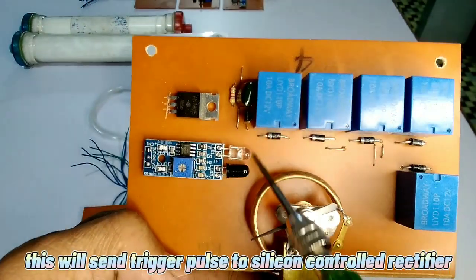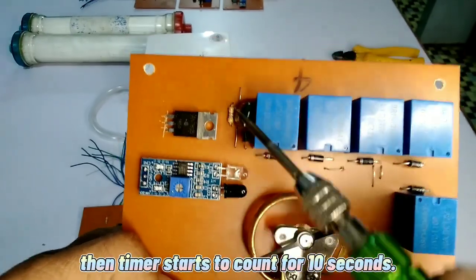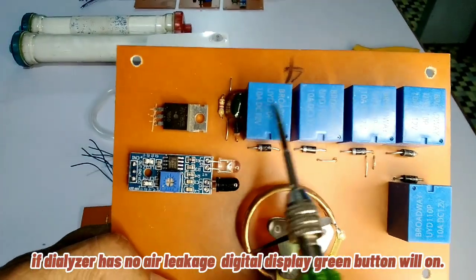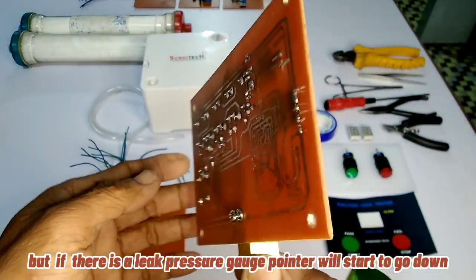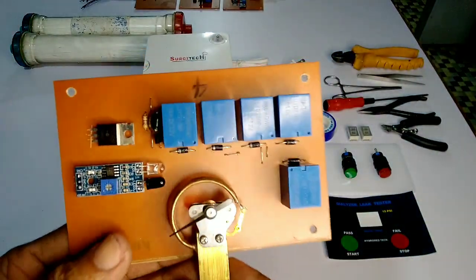This will send a trigger pulse to the silicon-controlled rectifier, then the timer starts to count for 10 seconds. During those 10 seconds, air pressure is held inside the dialyzer chamber. If there is no air leakage, the green button will light on. But if there is a leak, the pressure gauge pointer will go down and a relay will switch to fail, and the red button will light on.